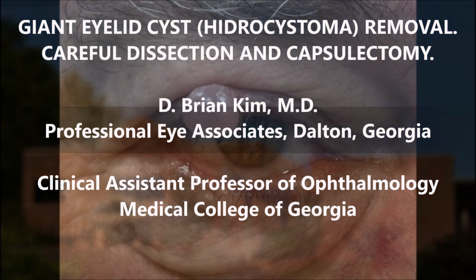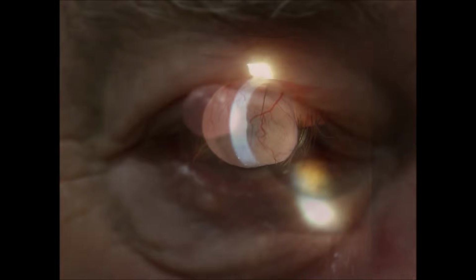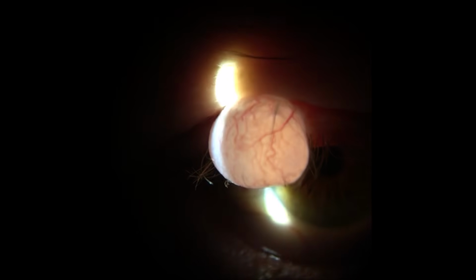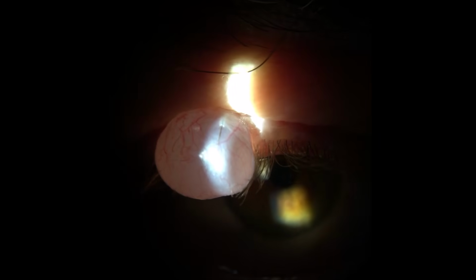So again, this is the patient's eyelid. Obviously, it's obscuring the vision, and this is functional resection of this inclusion cyst. You can see the transillumination with the slit lamp light. You can see actually there's a small eyelash that's inside the cyst as well.